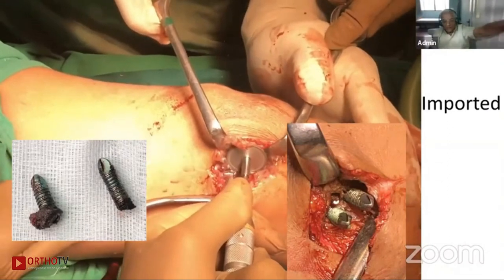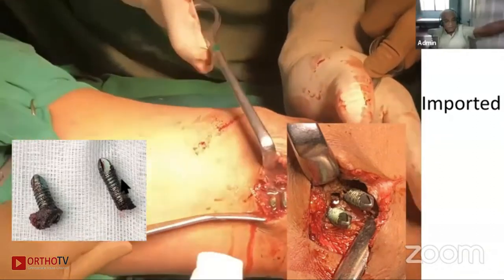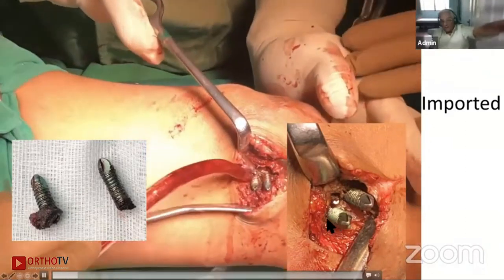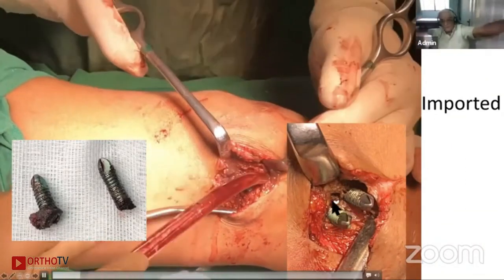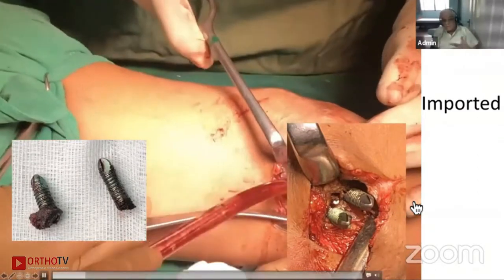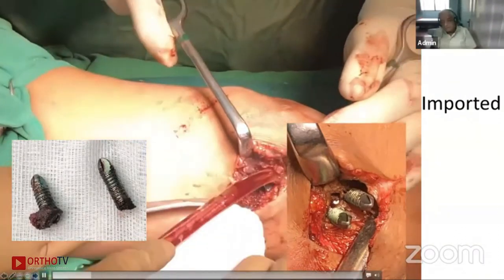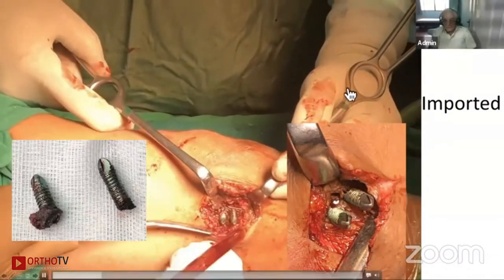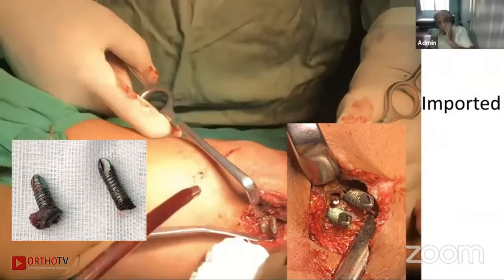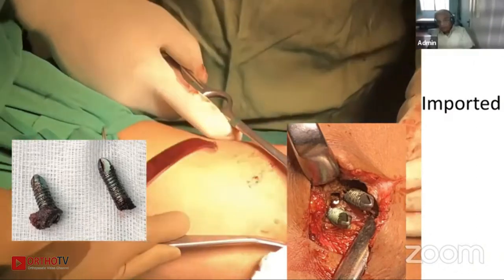You can see it, I am cutting in front of you. It takes hardly any time and the whole thing comes out and you will be able to just take it out like that. So this is an important instrument. Obviously, this is only one important instrument out of those 10 instruments I have shown, but it is one of the most important. You can have a metal cutting bar and you can have a metal cutting oscillating saw. So this is very useful. This is there in almost all the hospitals where I work, because we have been able to purchase this. This is extremely good. And the whole thing, which was so difficult to take out, just came out within no time.